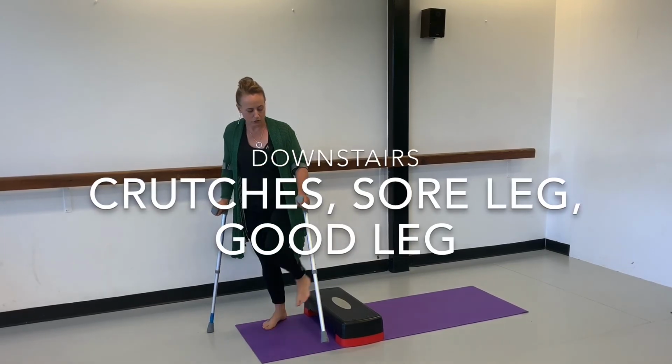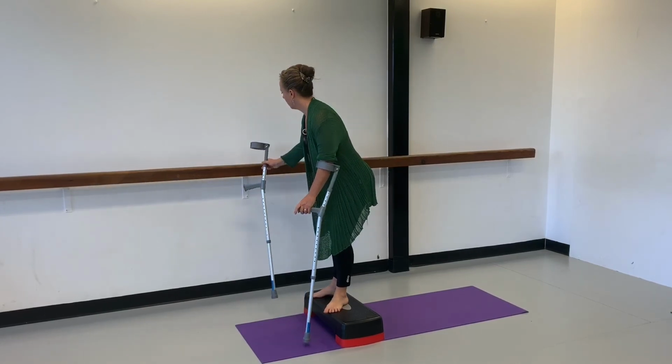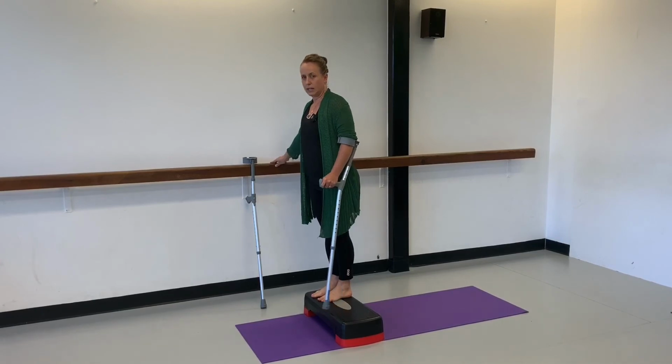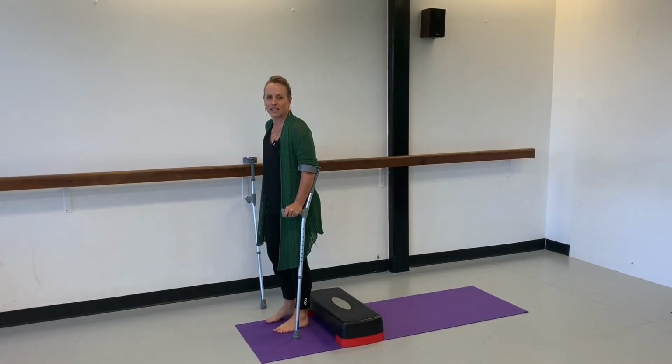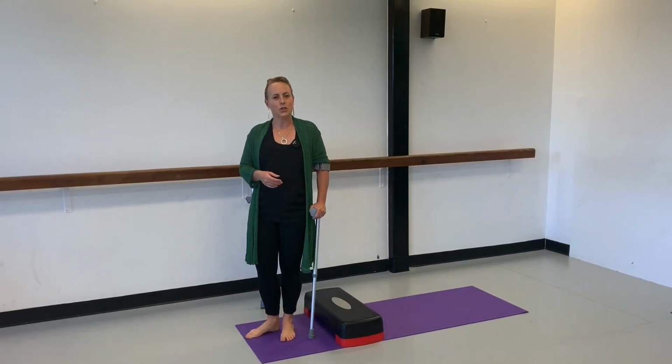It is a little bit easier if you have a rail, because then you can hold on to the rail, take your crutch, then your sore leg, and then your good leg, and the rail will give you some assistance. So I hope that information helps you on how to normalise your walking pattern after your hip surgery and use crutches effectively.